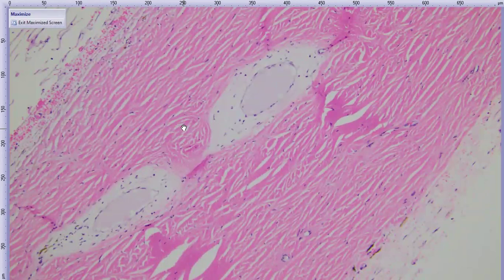Usually with corneal hydrops, we like to see breaks in Descemet's and separation of Descemet's membrane from the corneal stroma, which we did not see in this case. But we do have cases where animals getting systemic prednisone were affected with corneal hydrops, which this cat definitely had a lot of systemic, with the thoughts of GI lymphoma and having treatment like that.